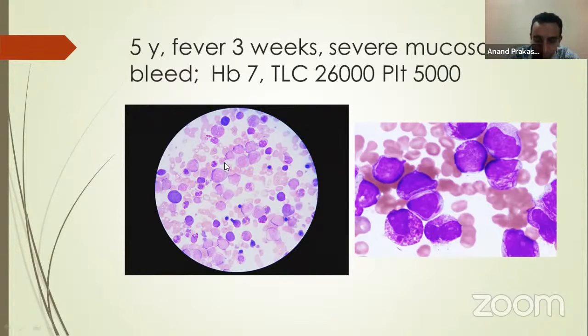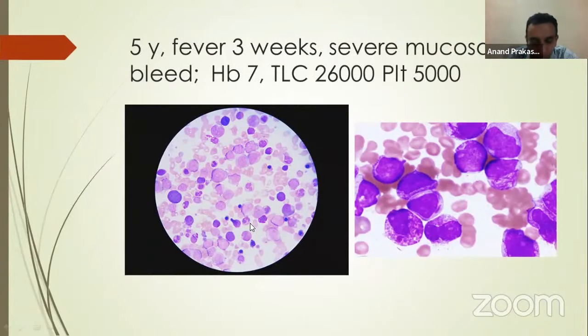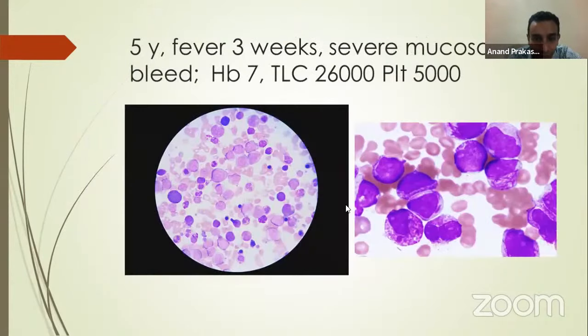If you compare these blasts, let's go back to the previous slide, with these blasts, the myeloid blasts are always bigger. The myeloid blasts will have more granularity. They may have Auer rods. The lymphoblast will have a more tightly packed nucleus, and the cytoplasm will be just a thin rim. So a thin rim of cytoplasm is a lymphoblast, whereas in the myeloblast quite a lot of cytoplasm is seen, look at all these cells. But the whole cell looks abnormal. Clusters of cells all sticking together and having a discussion are blasts.